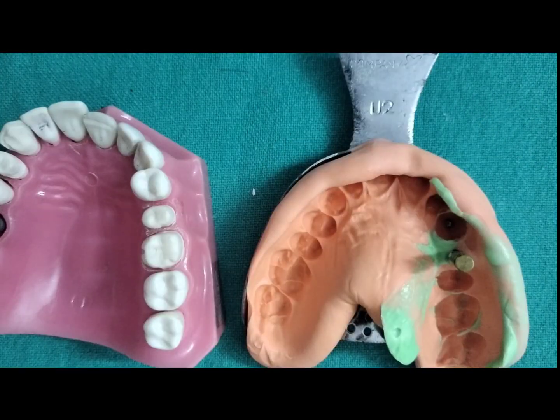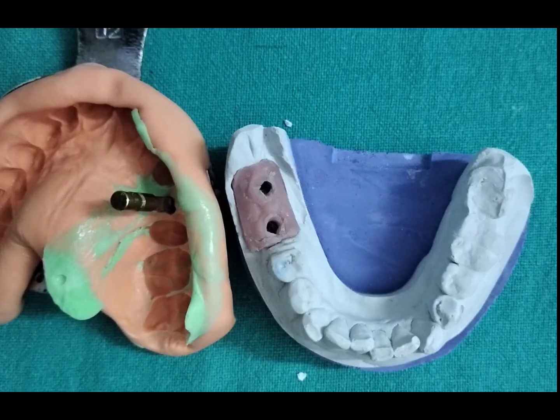Once you have repositioned the impression coping with the analog onto the impression, you pour it with gypsum to get the master cast. Before getting the master cast, you also pour around it the gingival mask so that you get an accurate representation of the gingiva when you are making the prosthesis.